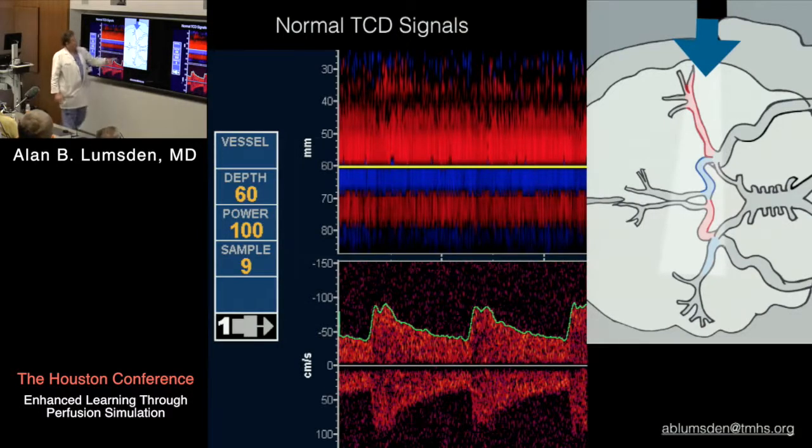So again, here's the thin head, the thin bone. You put an ultrasound on there, and it fires an ultrasound beam across that line, okay? And you can get it on the other side of the head. Now, God designed the cerebral circulation for transcranial Doppler. He was a forward-thinking kind of guy to make it easy to do that.